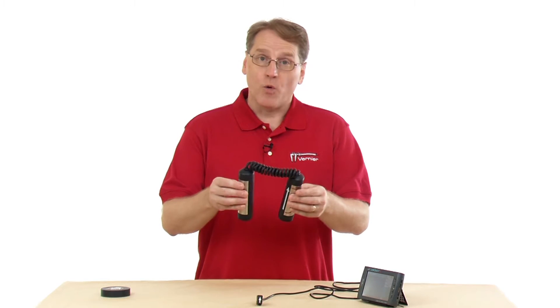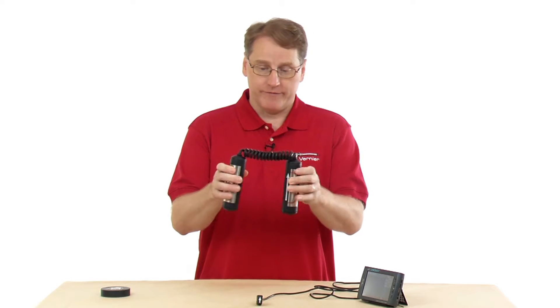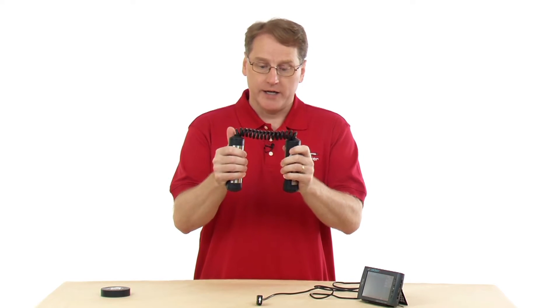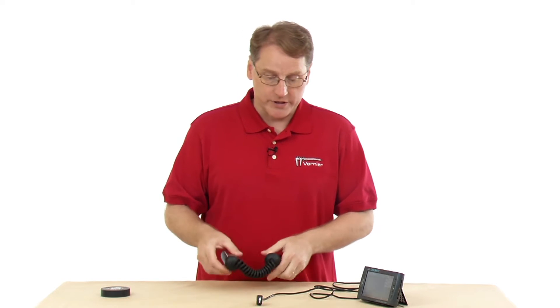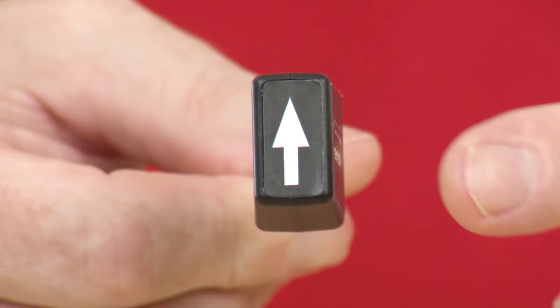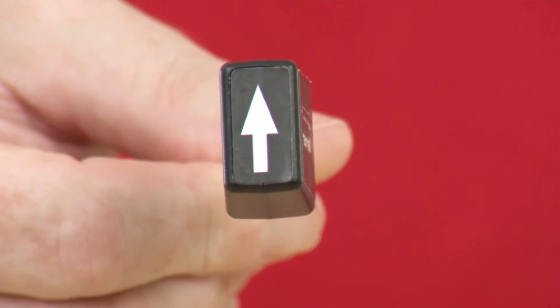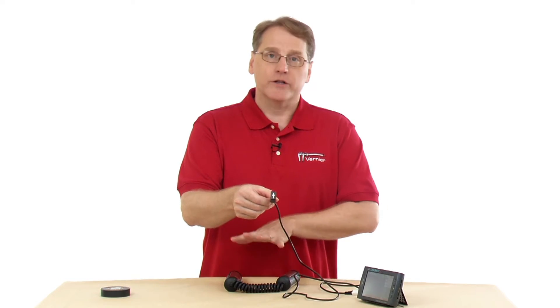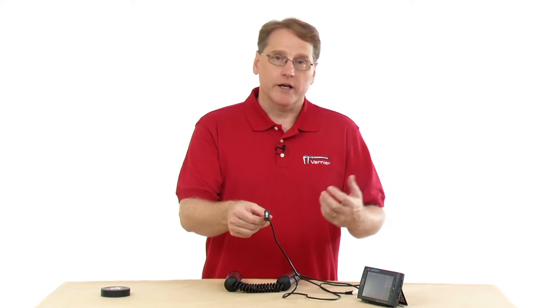It's a wireless sensor. It communicates from this hand grip piece — you hold it in your hand and it sends the signal from your heartbeat to this receiver, which plugs into the LabQuest 2 or whatever interface you're using. It picks up your heart rate and measures beats per minute and displays that.